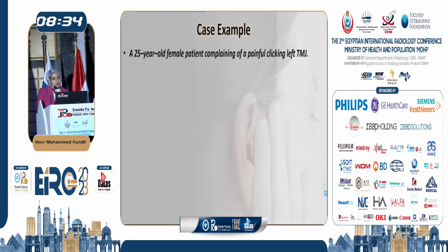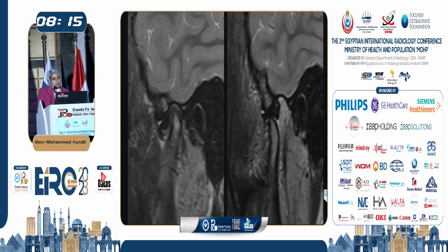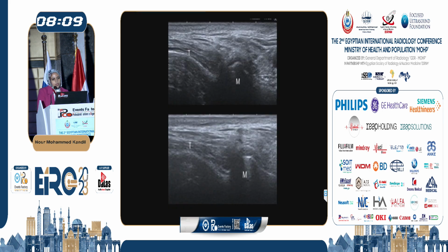A 25-year-old female patient complained of a painful clicking left temporomandibular joint. The patient had a previous MRI and was diagnosed with reducible anterior disc displacement. The patient then sought medical advice in the oral maxillofacial department and was referred to the radiology department for ultrasound-guided prolotherapy injection. T1 sagittal MRI closed view shows anterior displacement with reduction in the open mouth view.